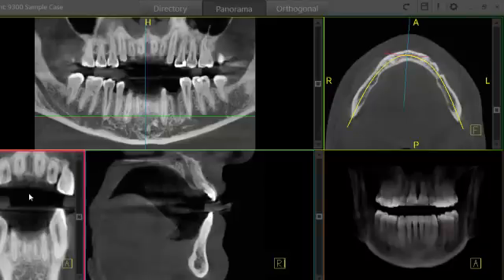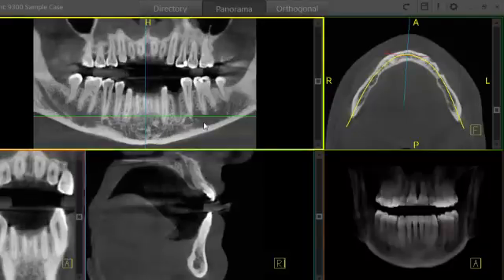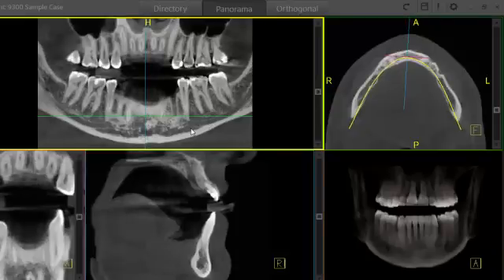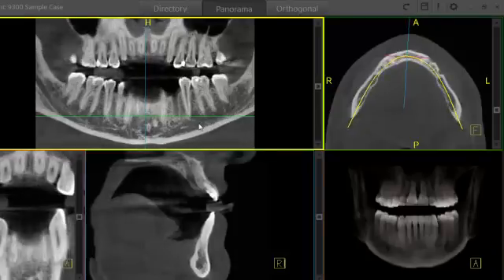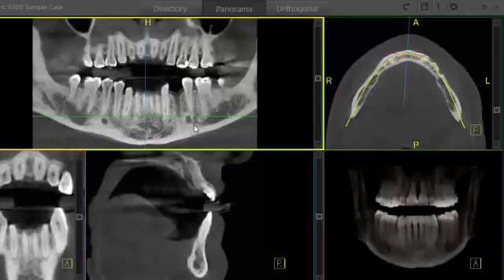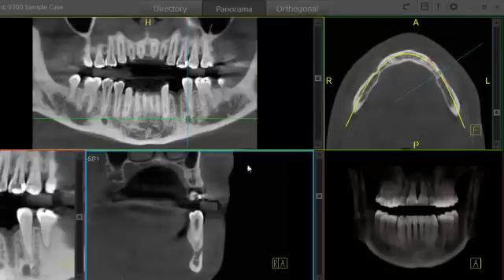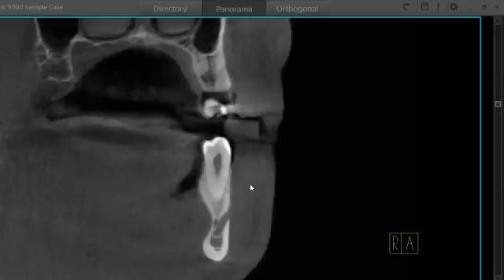Before we start to plan our implant, I want to go ahead and map our nerve. I can roll through my slices here — you can see the nerve canal. I'll roll up until I see the mental foramen, then click right in the center, which aligns all of the views, most specifically the cross section. That's where I'll start — you can see where our nerve begins.